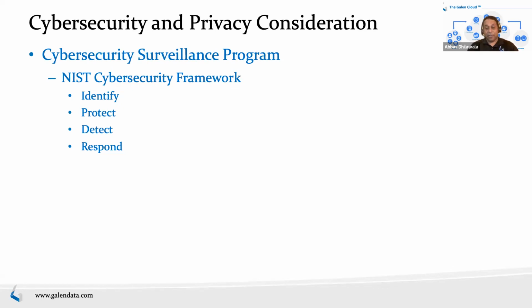And it's not just technical response, but also a lot of legal and regulatory response, right? So if an event happens, you may be required under law or under whatever frameworks you are to notify, let's say, government agencies, patients or providers, and a lot of these have certain deadlines. For example, under GDPR, the European standard, you have 72 hours. Some states in the US have as little as 24 hours to notify. And you have to notify different people, and it depends on how many people are affected.